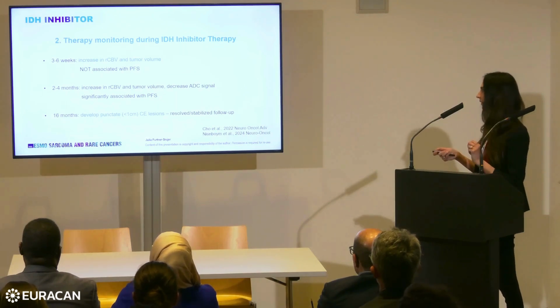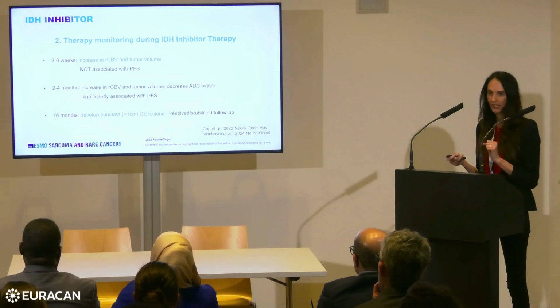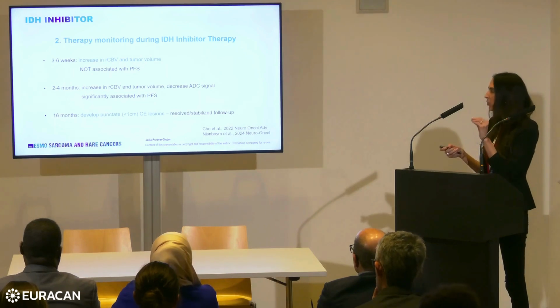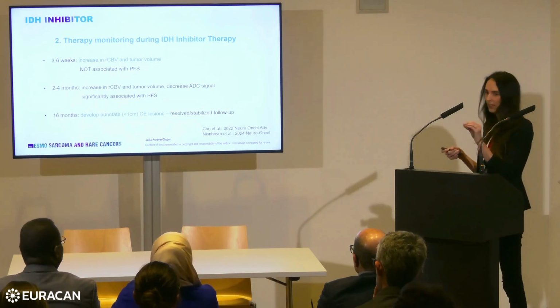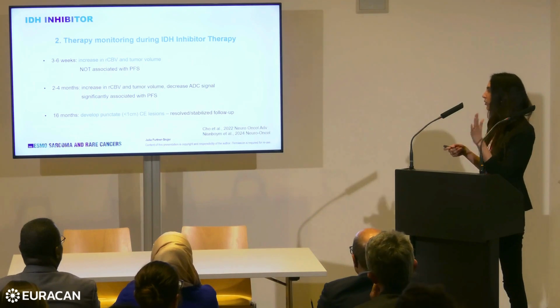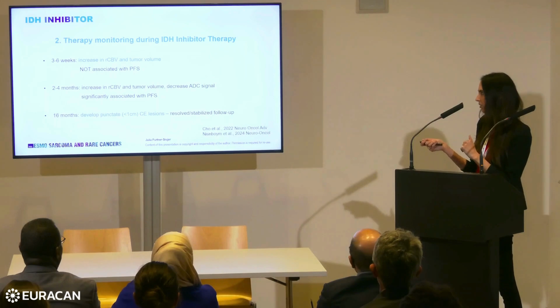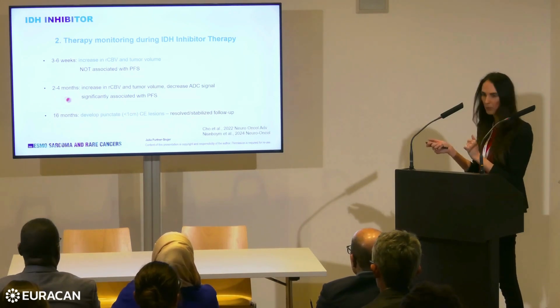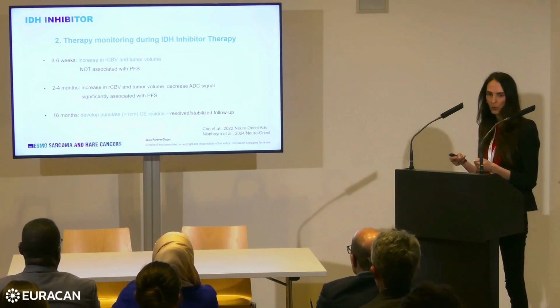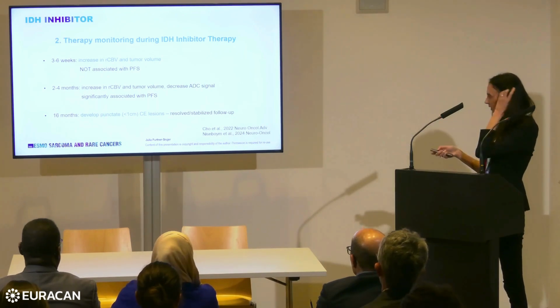The second thing is that after 16 months of therapy initiation, a group found that the patient develops very small punctate contrast-enhancing lesions under 1 centimeter that resolved or stabilized in the follow-up examination. So if you find such lesions around this time point, please do another MRI follow-up examination just to be sure that this is real tumor progression or it's just such a lesion that resolves.